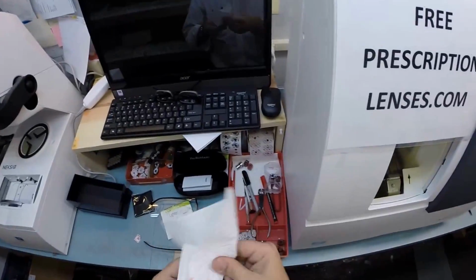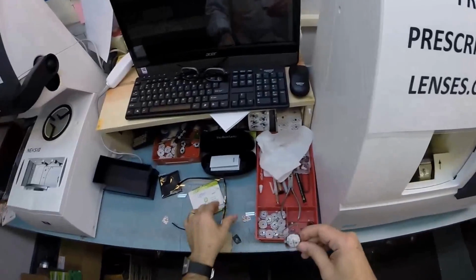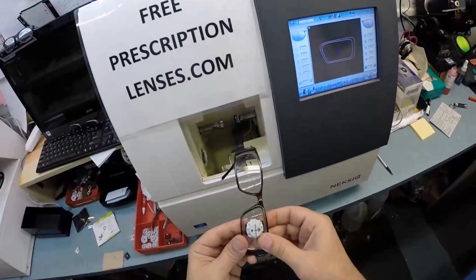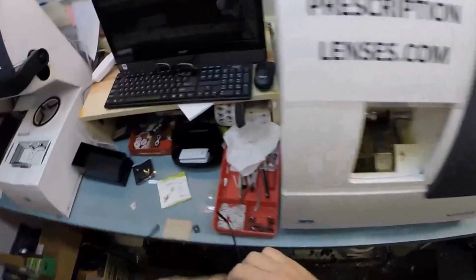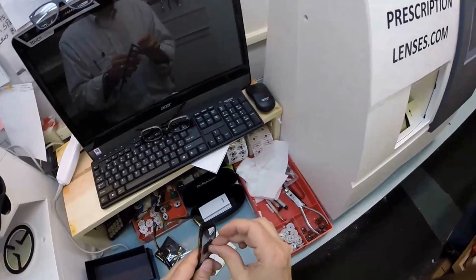We're going to take it out of the chuck, dry everything off, and then starting with the outside corner, tuck that in there, and then push down at the nose. It snaps in perfectly. I'm going to take this block off. It always takes a little longer for the right lens, but once you get that size right, just flip it over and cut the left.